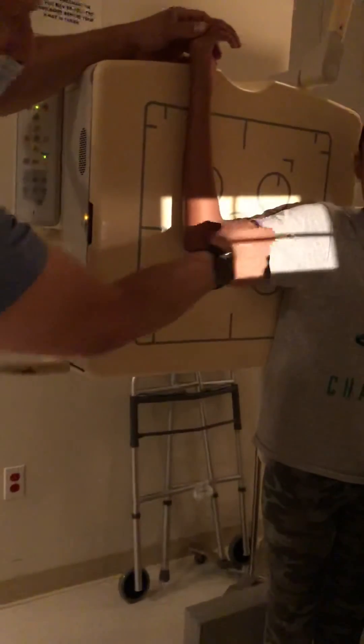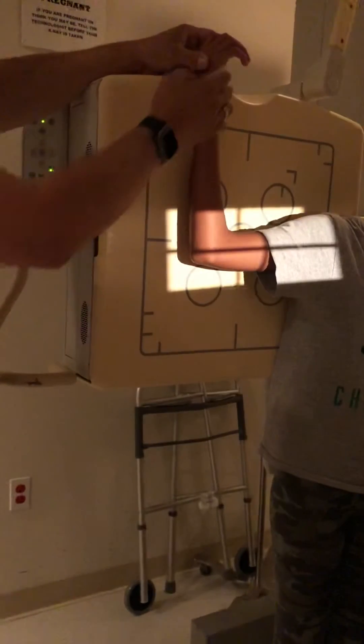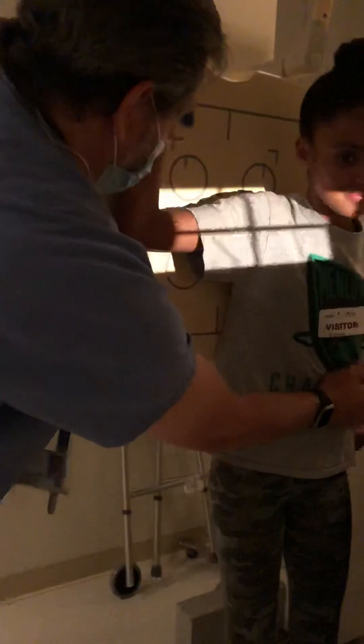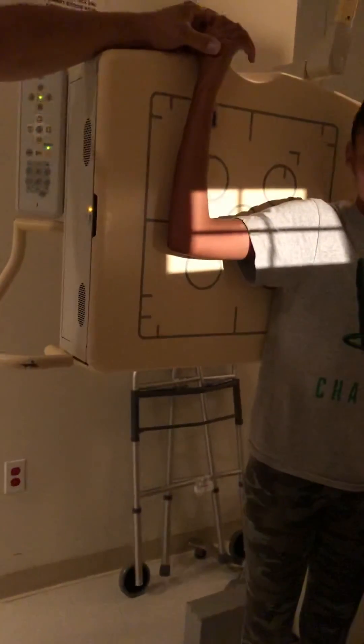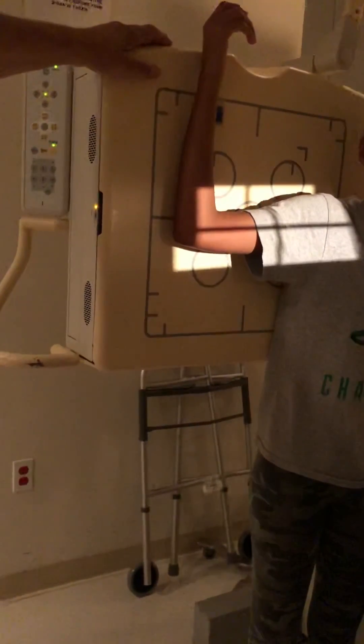You want the beam right down the center of the arm, and if you can, try to keep the elbow at a 90-degree angle. And those are the two pictures you need right there. This is how you do the x-ray of the humerus. If you like the video, please like, comment, and share. Thank you.